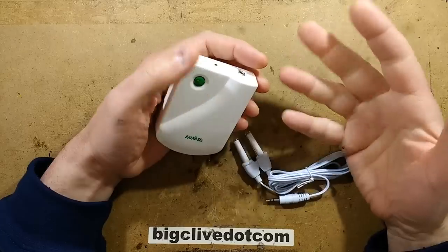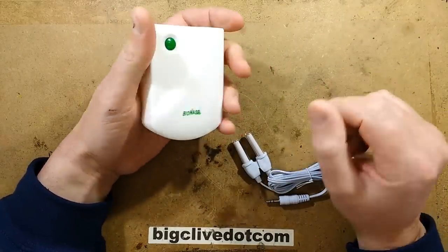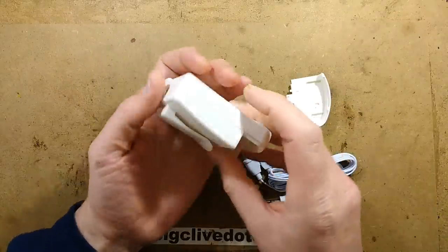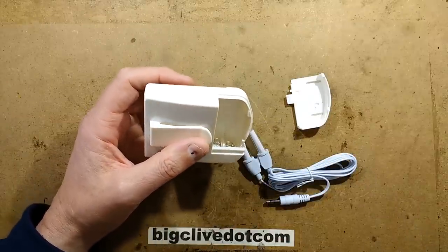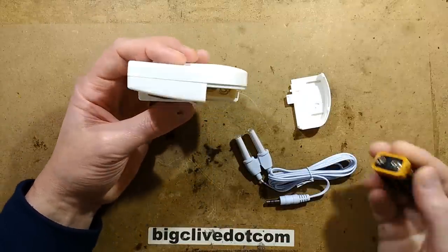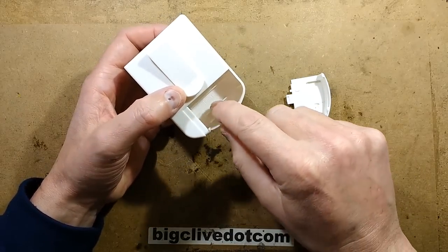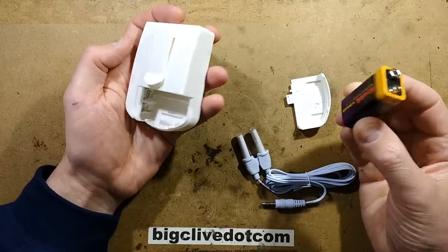Some of them go further and claim that it pulses the LEDs at specific frequencies. The only way to find that out is to actually check if it is doing that. The battery cover comes off and there are a couple of spring contacts inside. It takes a PP3 battery. Not very well marked — very hard to see the markings as they're just embossed into the plastic. Don't know what happens if you put it the wrong way around; it may die, it might not.